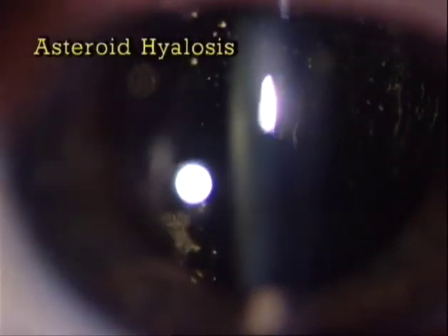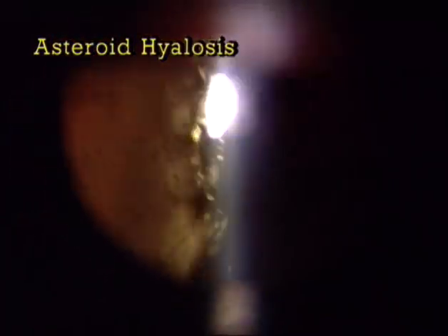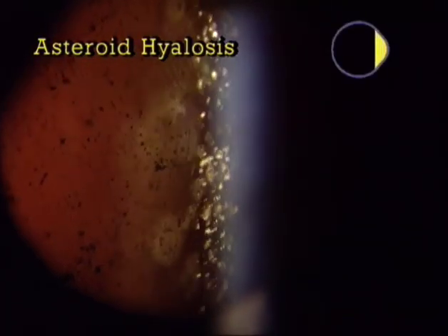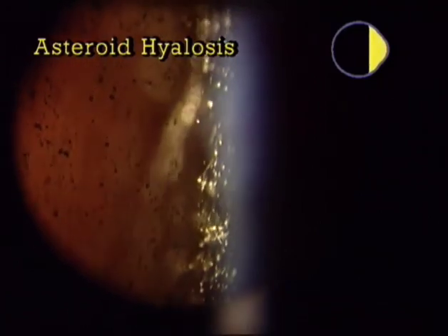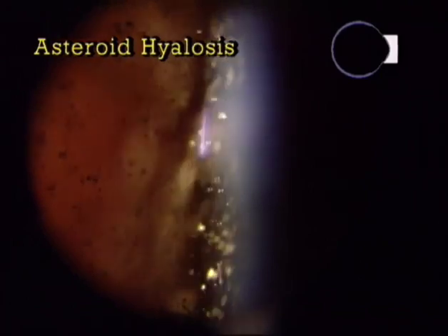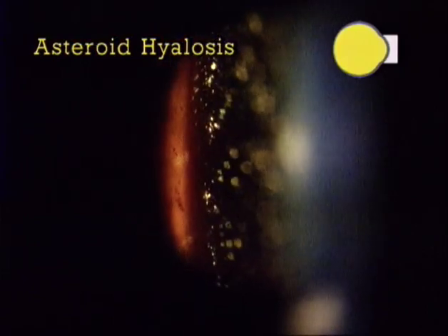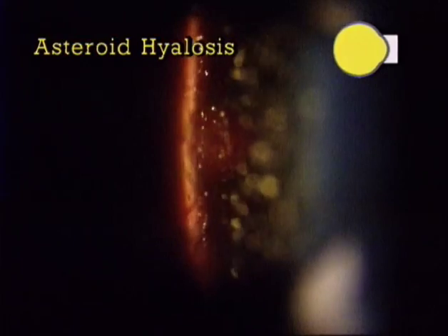This case of white asteroid bodies floating in the vitreous shows that the slit lamp permits the visualization of the anterior third of the globe only. That means much less than with an ophthalmoscope. Special auxiliary devices are needed to reach the posterior fundus, which allow us to follow the asteroid bodies up to the preretinal vitreous and also to see the retina and the disc.